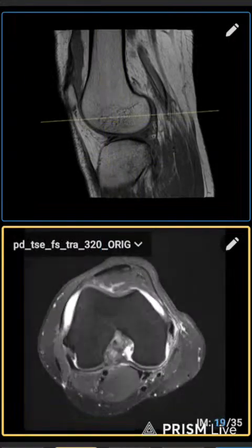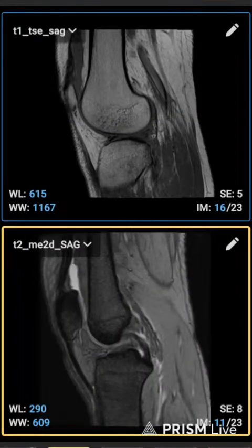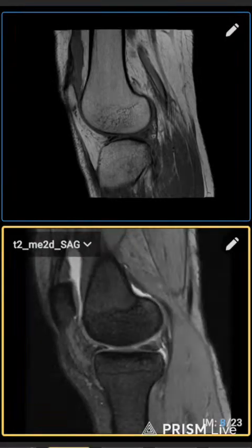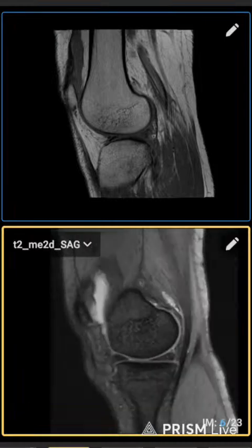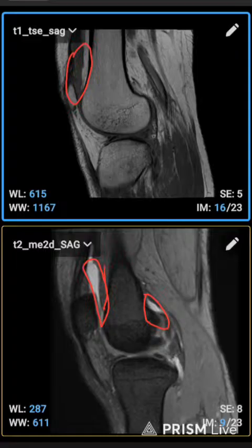In this patient, there is an injury history, so if there is an injury history, the GRE sequence is needed. It's not recommendable to say whether it is a collection or a hematoma from injury, so we need the GRE sequence. If you see bright in GRE, it means this is edema.